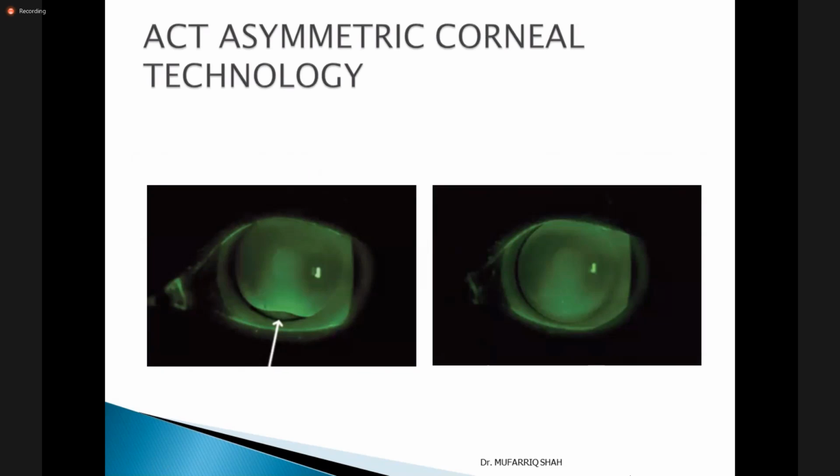Now here, can you see at the 6 o'clock? Edge lift is much greater here. Yes, sir. It is even standing up. So the center is good, the periphery and other quadrants are good, at 9 o'clock, 3 o'clock, and 12 o'clock, fitting is optimum. But at 6 o'clock, edge lift is much greater.